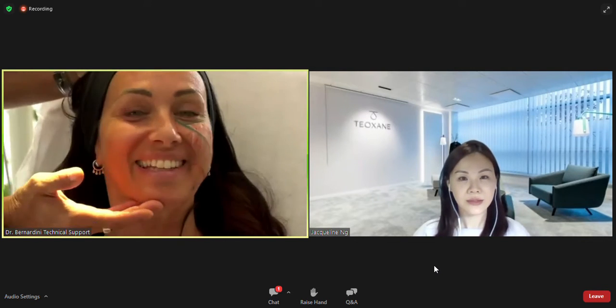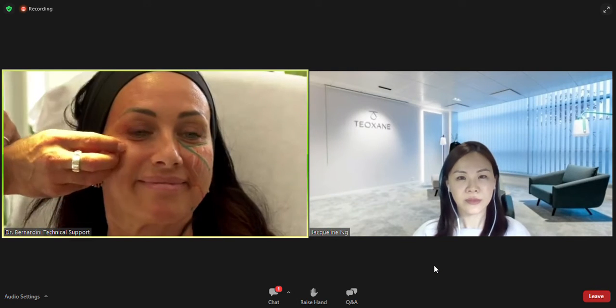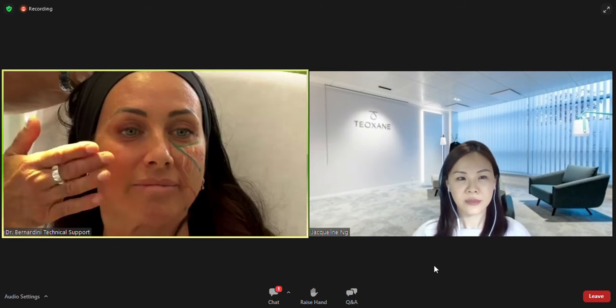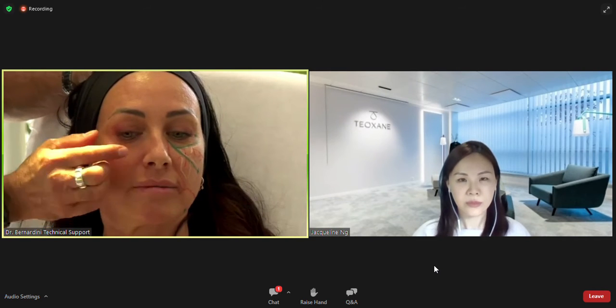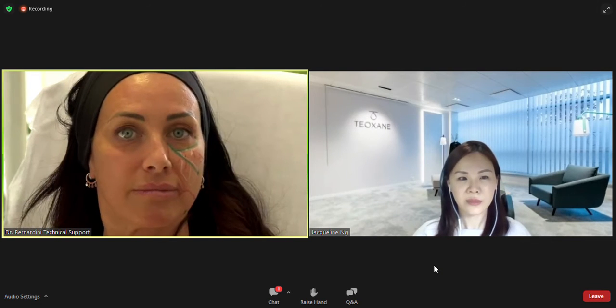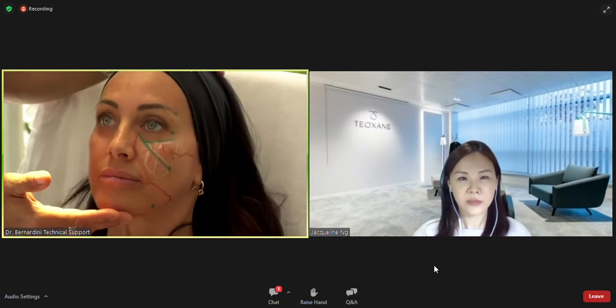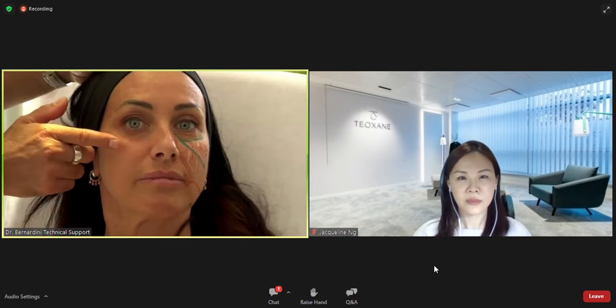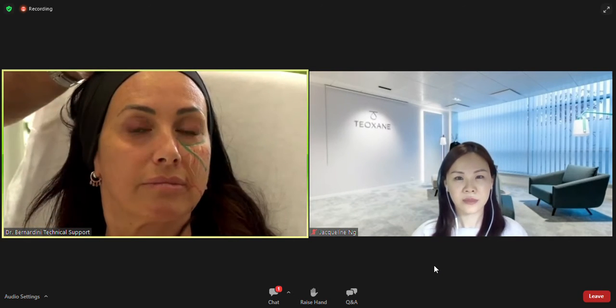As you see, she has a beautiful mid face because the cheekbone gives support to the entire mid face. But as soon as she relaxes her smile, you will see that even with a strong cheekbone, you do have some infraorbital defect. You see it from centrally here to laterally here. High cheekbone and then lack of volume right below.